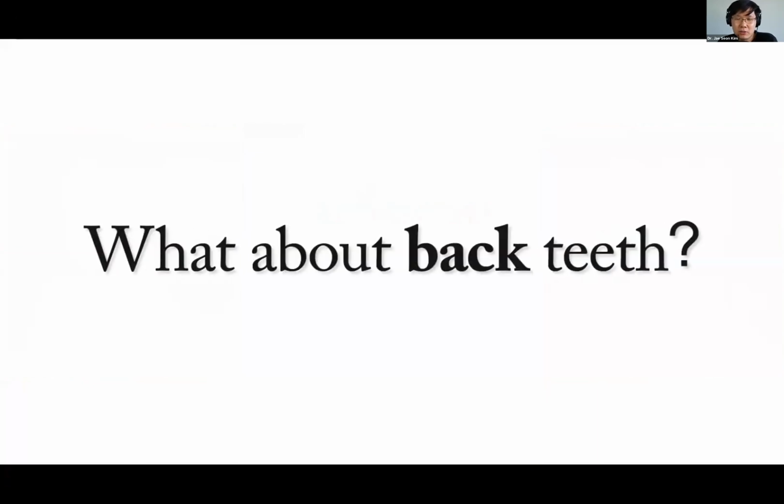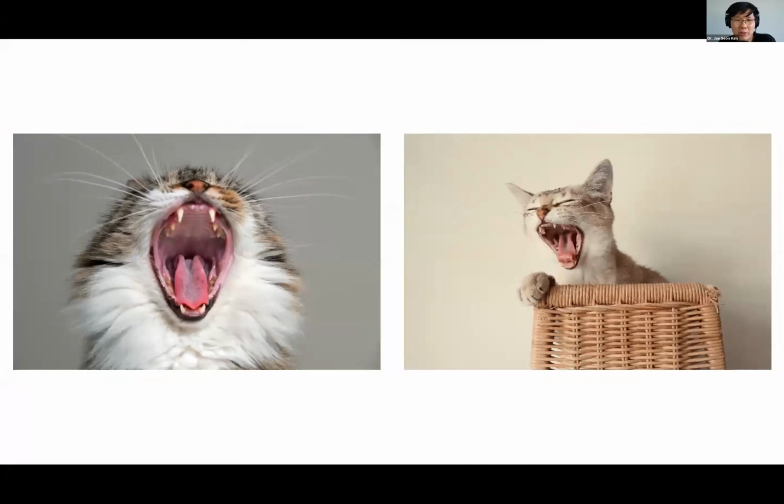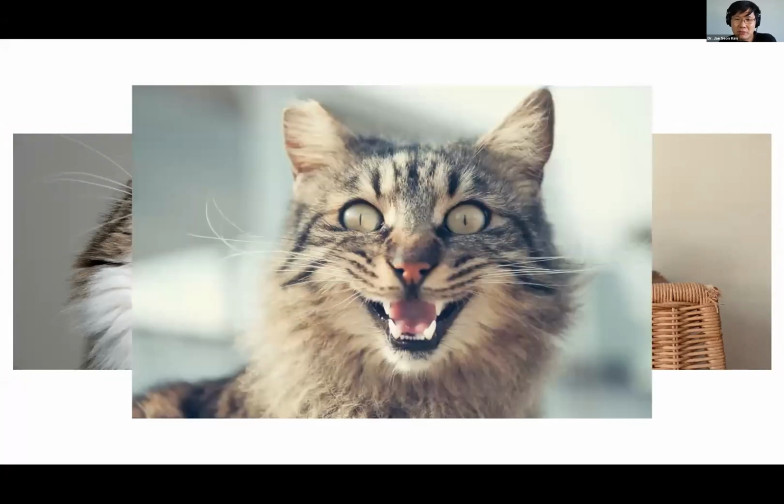All right. So we talked about front teeth all this time, but what about back teeth? They said I'm going to talk about posterior teeth, right? So back teeth, I wish all my patients could open like this, but the truth of the matter is most patients open like this, right? And then you try to put this huge gray card into the back of the mouth, and it never gets past the first premolar. So what I do for posteriors is I don't use this gray card.